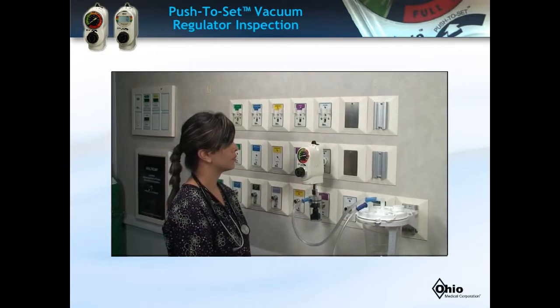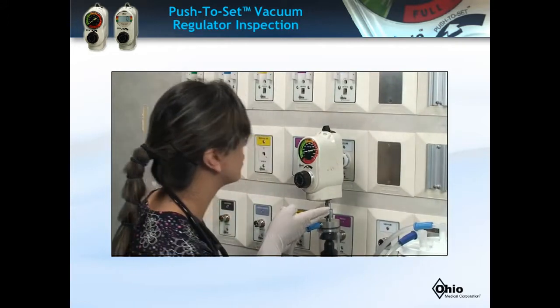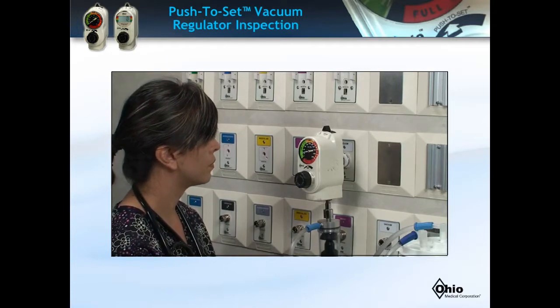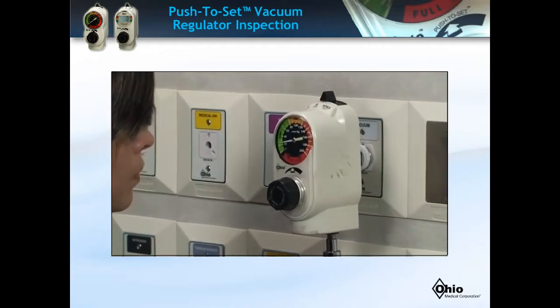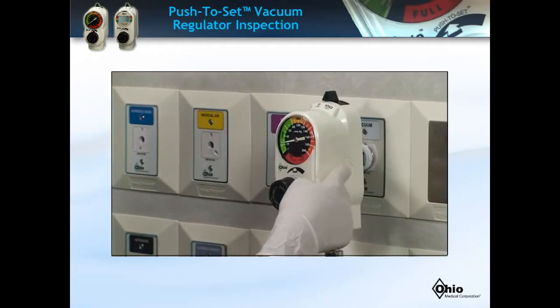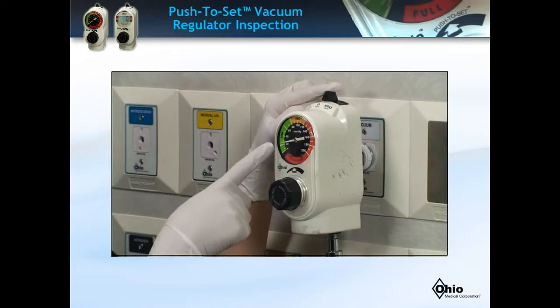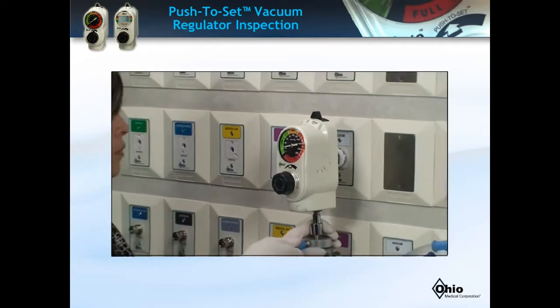Clinicians should inspect for damaged or broken regulators before use to avoid potential patient harm. First, inspect the regulator. As shown in the video, if the unit has broken parts or the housing is damaged, or while in the off position the gauge shows a value other than zero, the unit should be replaced as per your hospital's protocols.